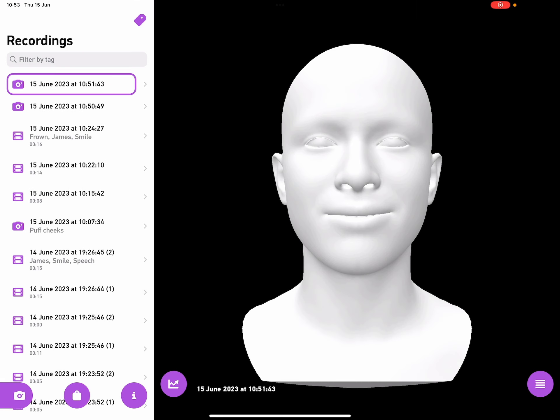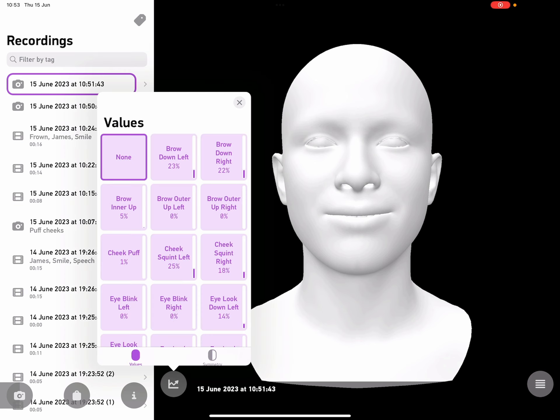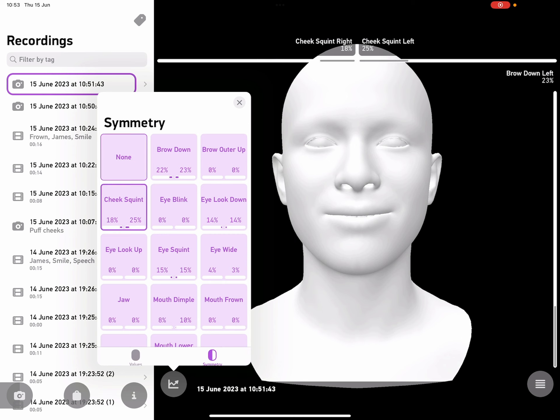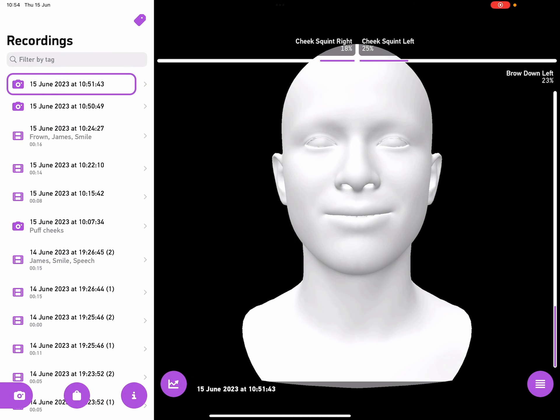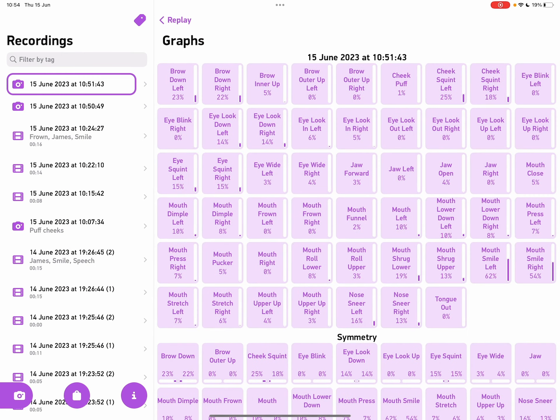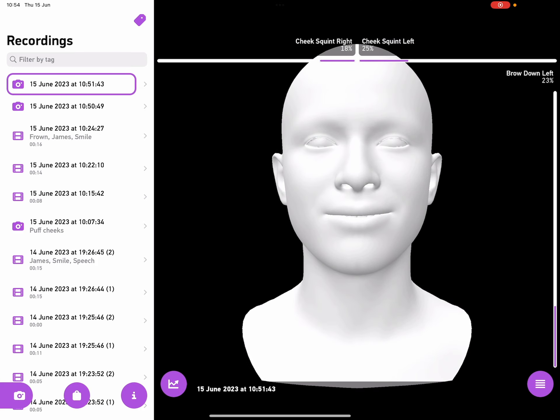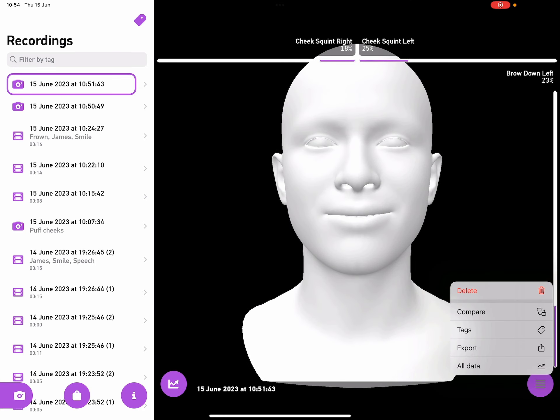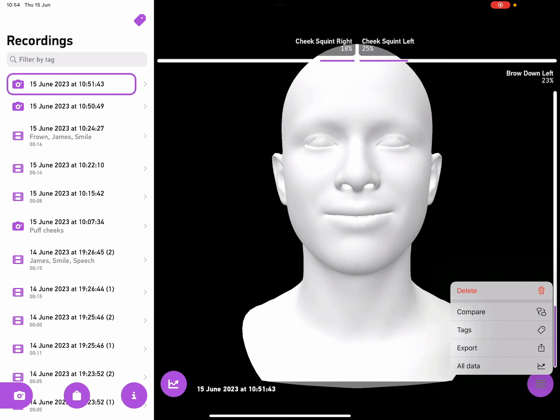Now we don't have a progress bar this time, but everything else works exactly the same. We've got the values. We've got the symmetry. And over on the left, we can see all the data. Or we can export the data, tag the photo, compare the photo, just like a video.